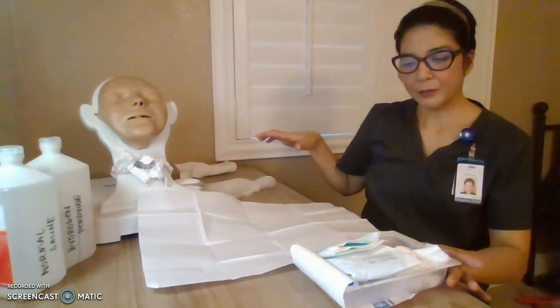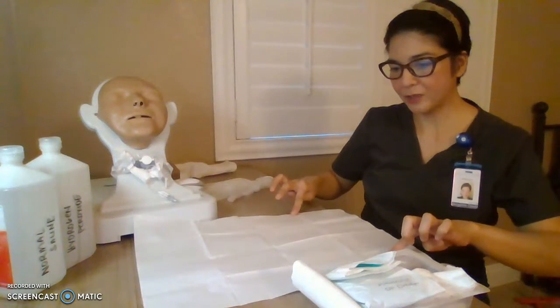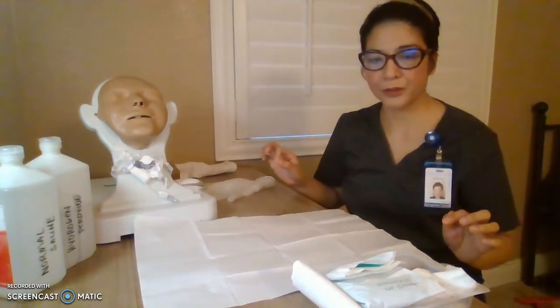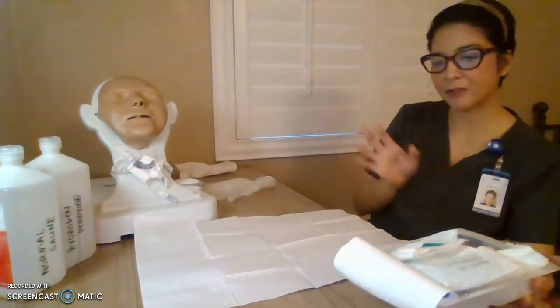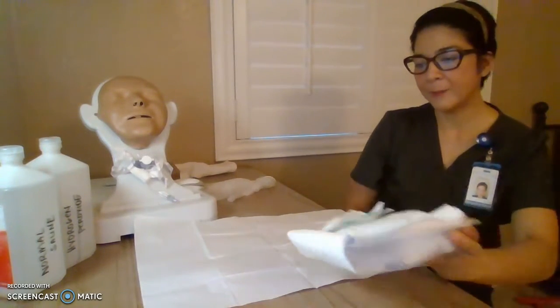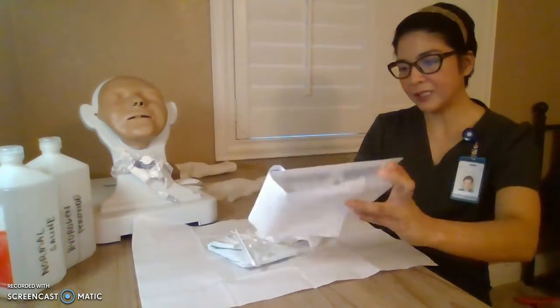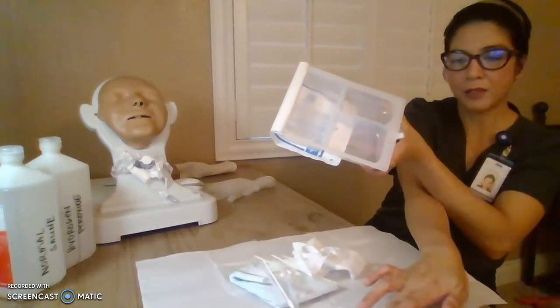Okay? I'm just going to move this. You can maneuver by touching the inch border, the outer border of it. So our goal right now is to have everything inside that sterile field. Do not hover around that area. So just drop everything in. For the purpose of the video, I am going to move this over.